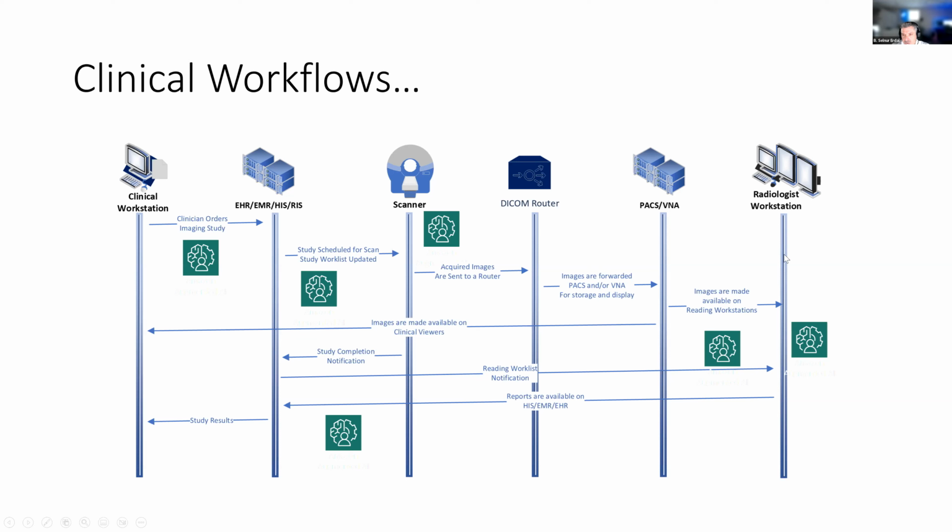As I'm describing more and more complex cases, there are a couple of things. One, everything is flowing. It can be images, DICOM, HL7, different standards, but this engine has been flowing for years within standards. But traditionally today, when you're developing an algorithm, you might have found a nice, clean data set that you collected from various research settings.